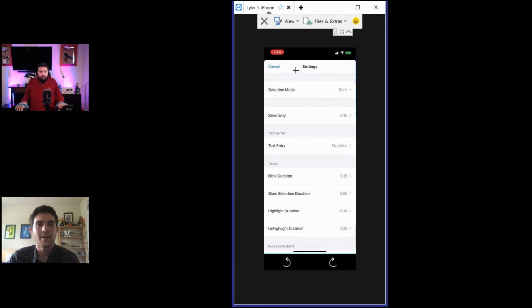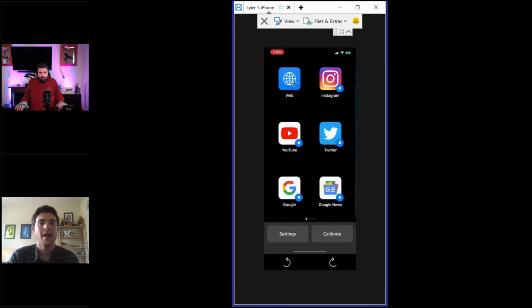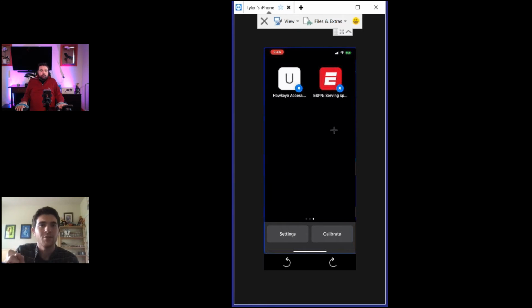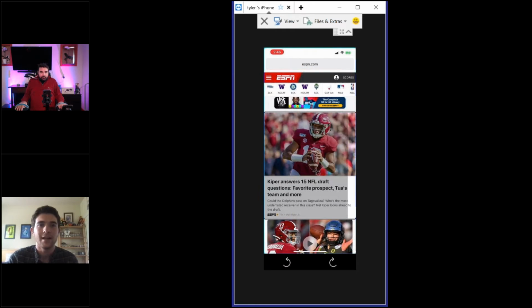Stare is definitely a lot more difficult to use. We wanted to include it just because it's the minimal amount of functionality needed to use the app, right? So if all you can do is move your eyes, then stare works for you, even if controlling your blink is challenging or smiling is challenging. But that being said, it's definitely the hardest to use because when you look at a UI element, a little progress bar will appear, and it only clicks after that progress bar completes. So if you're moving around a little bit or your eyes aren't super steady, then maybe the cursor moves off of the button before it finishes selecting.